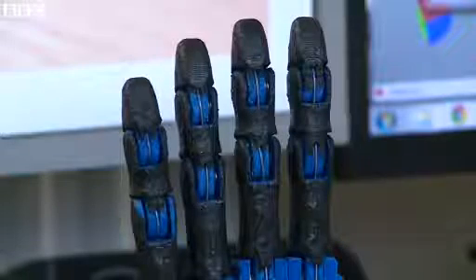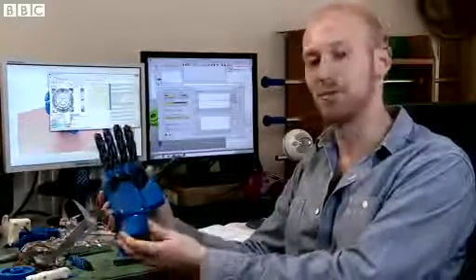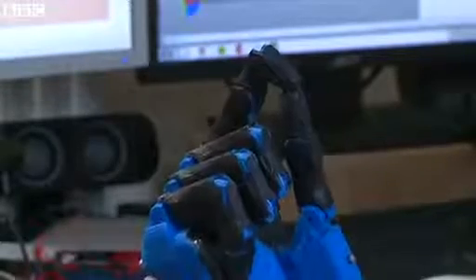So this is the dexterous robotic prosthetic hand, and it's a low-cost robotic hand made out of 3D printed plastic. And I can close the fingers, and as one becomes impeded, it will stop trying to close. A nice test of this is using an egg, because it's a delicate object and it's also quite a strange shape.